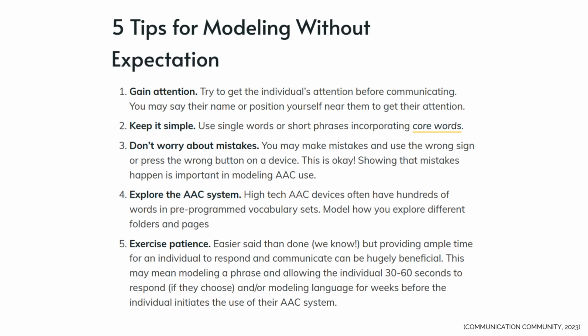When using AAC in a session, occupational therapists and speech-language pathologists model without expectation. I don't know about you, but I'm not perfect during verbal communication, so we should not expect perfection from AAC users either. So here are 5 tips for modeling without expectation. Pause here to read more.